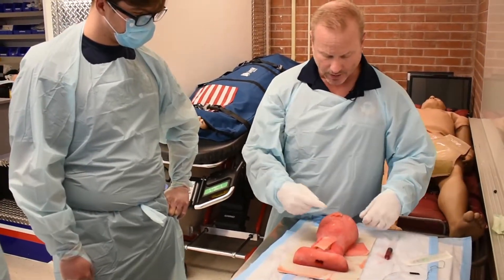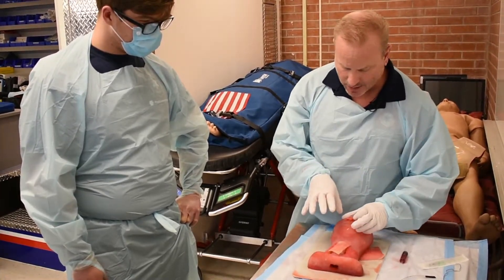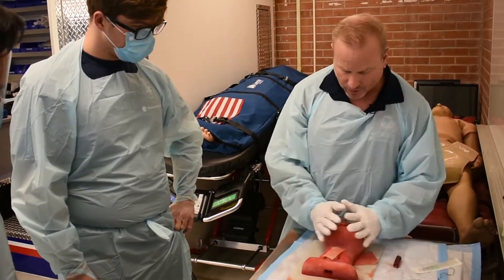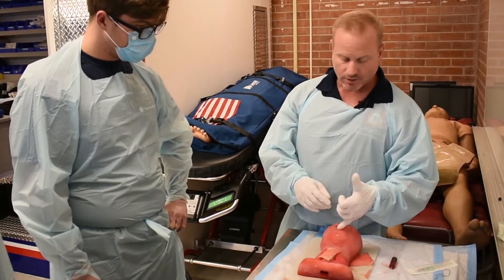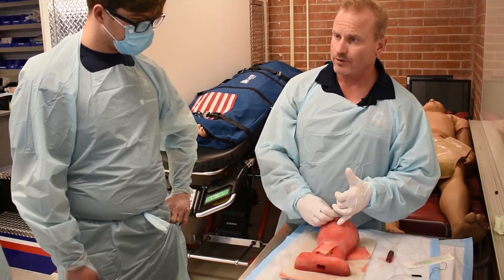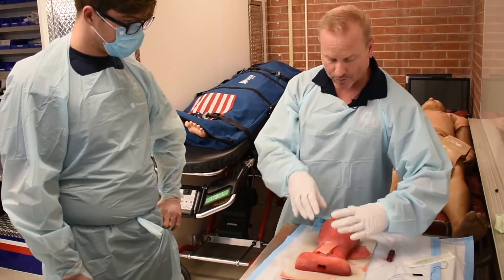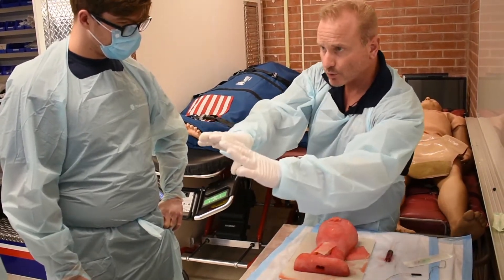I can't bag them. I've got an OPA. I've got bilateral NPAs. I squeeze. I've repositioned the head. I squeeze and all that's happening is our cheeks are puffing out. I'm not getting oxygen in. I will give myself one chance to tube him. If I can't tube that patient and the sat is starting to fall, I'm going to say, 'Make it happen,' and crike. And now I go from a primary role to a support role.